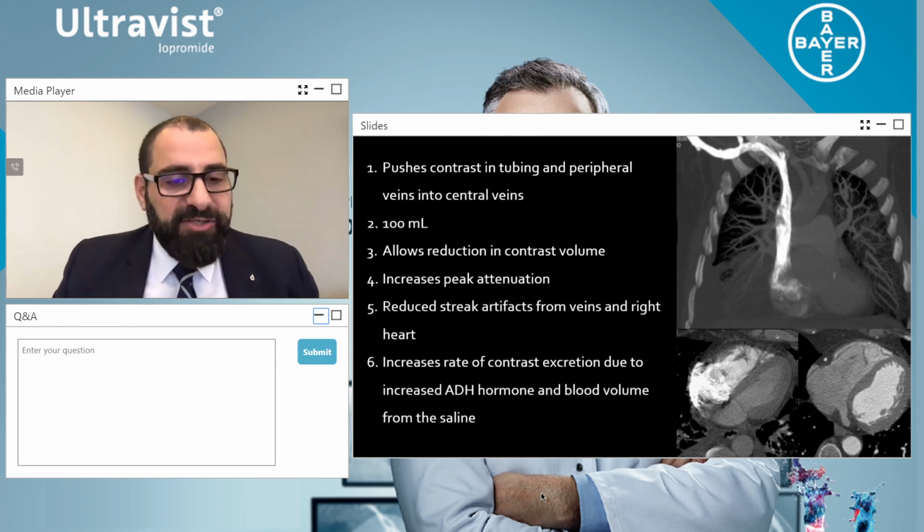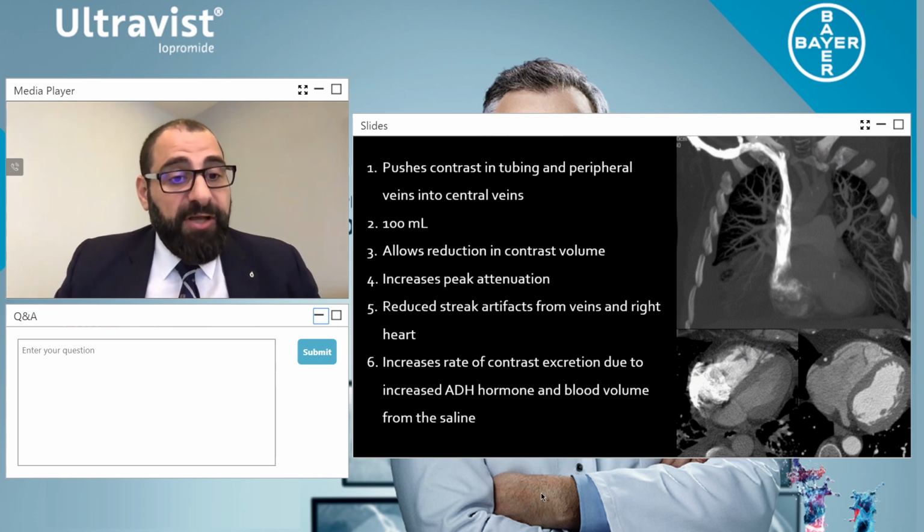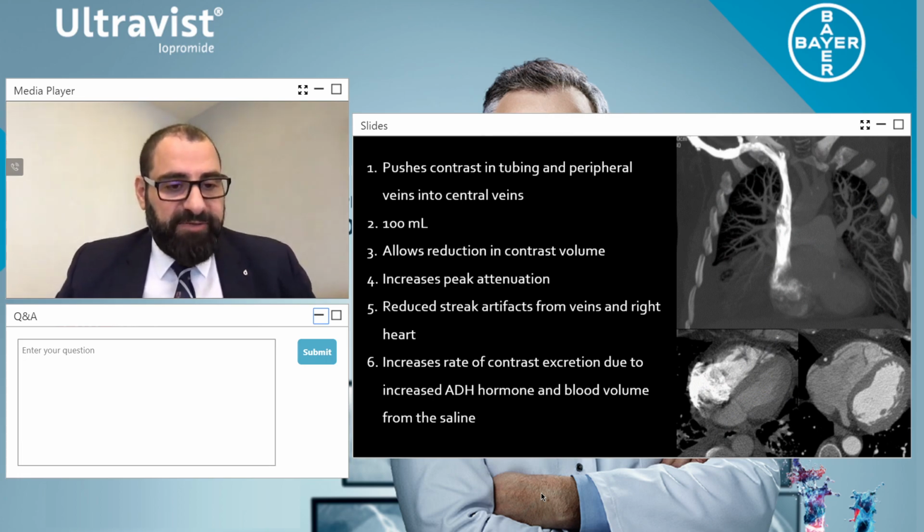Khan Nguyen asks, how much saline volume do we give for patients? Dr. Khan is from the Children's Hospital in Vietnam, and I've had the pleasure of meeting you. Lovely to have you on. So I usually, for pediatrics, for every kilo, 1 mil. So if it's a 3 kilo patient or 4 kilo pediatric patient, I go 4 mils. If it's 16 kilos, I go 16 mils for that.